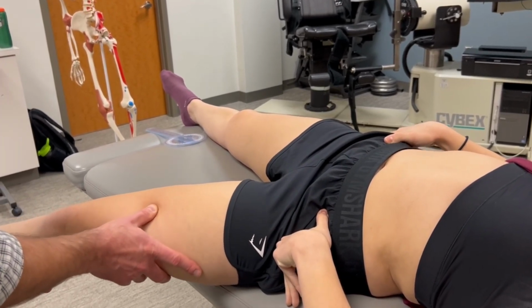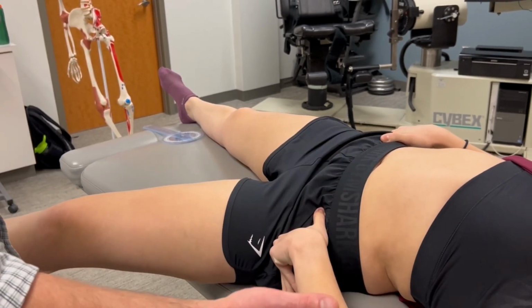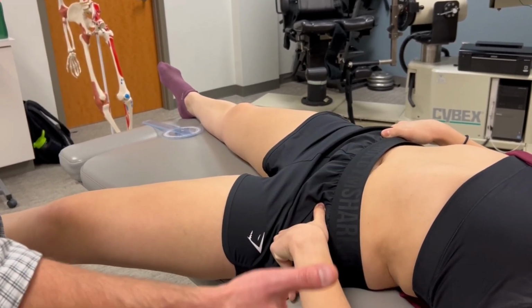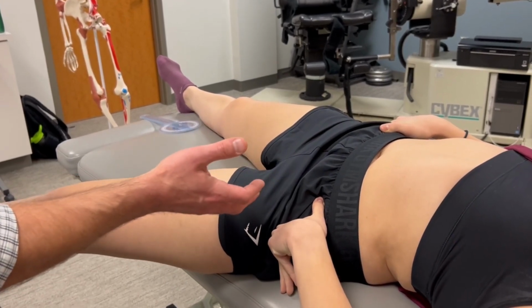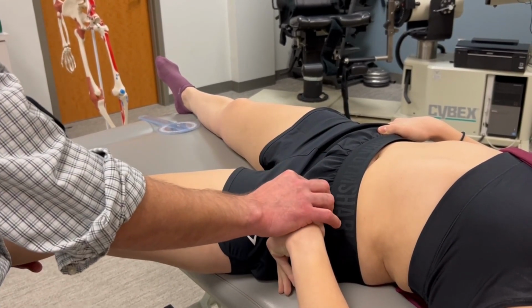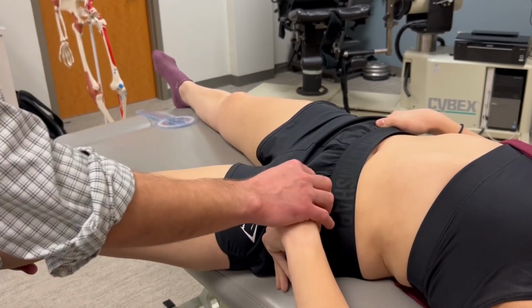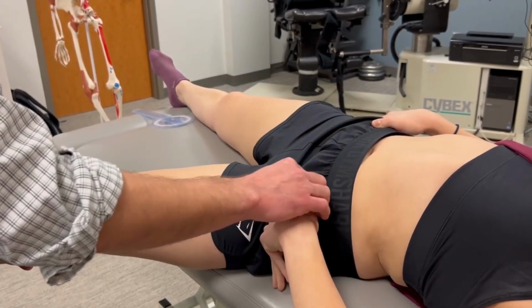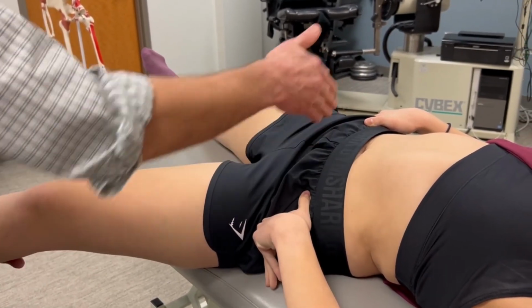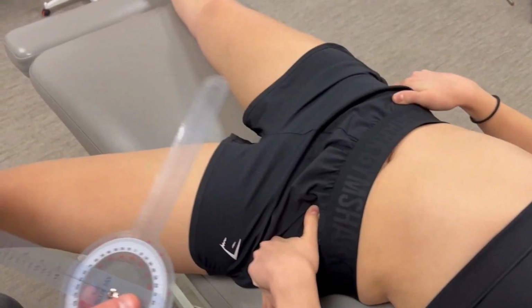What can happen with this measurement is we talk a lot about pelvic substitutions, we talk about scapular substitutions with glenohumeral range of motion measurements. Same thing applies for the pelvis when you're measuring hip range of motion. So in this case, we allow the substitution to occur, which is elevation of the ipsilateral pelvis. What we'll need to do when we take our measurement is just change the alignment of the reference arm to account for that ipsilateral pelvic elevation.